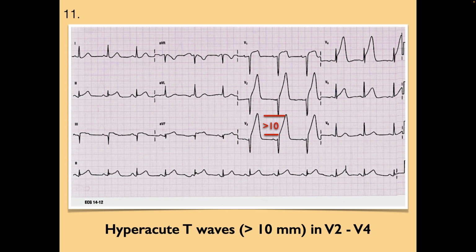Now I think, Kyle, this is the one you asked? I think it might have been whether these are... There's a different one. Oh, okay. The difference, because it is kind of pointy, is that the hyperacute T waves tend to be bulkier, sort of wider at the bottom.